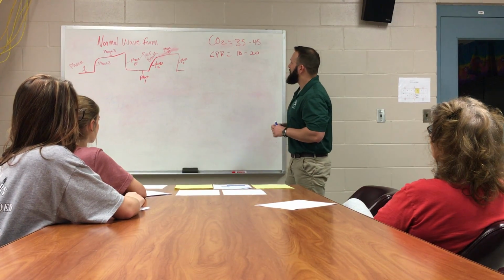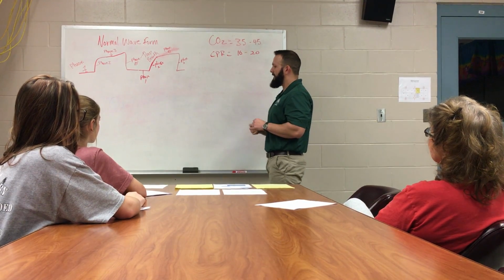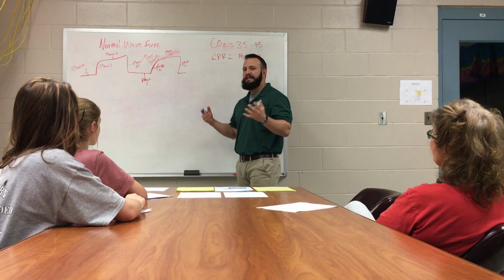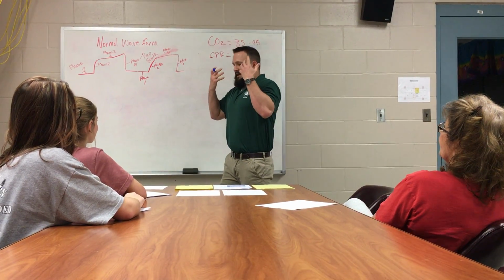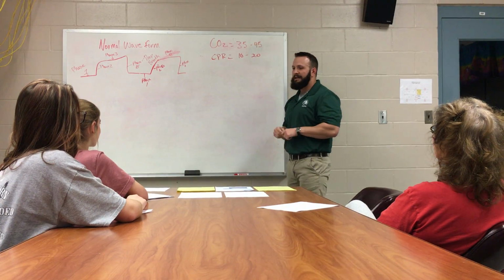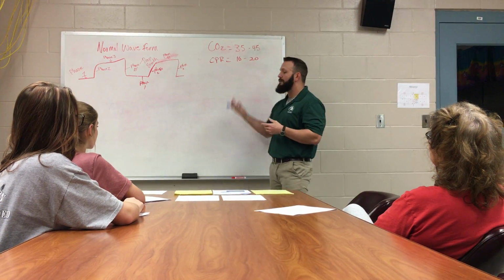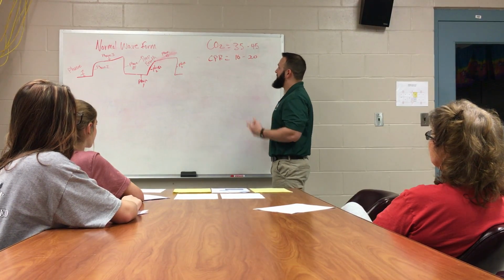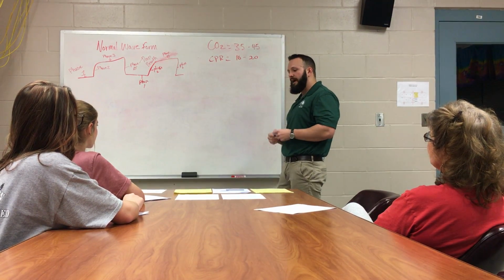So today we're going to be talking about end-tidal capnography that monitors CO2. Well, we all know CO2 is our byproduct from oxygen exchange. So if we all take a good deep breath and we all exhale, as we exhaled, we just exhaled CO2. So end-tidal capnography is going to be the way we monitor what we exhale and how much of it we exhale.